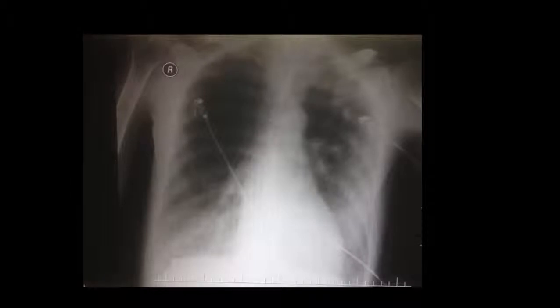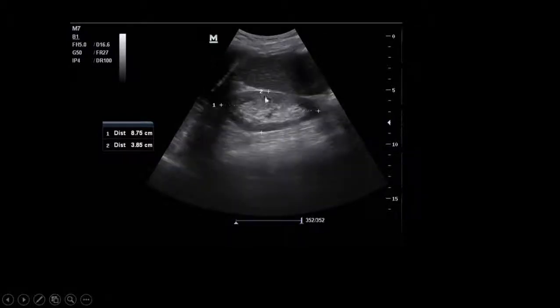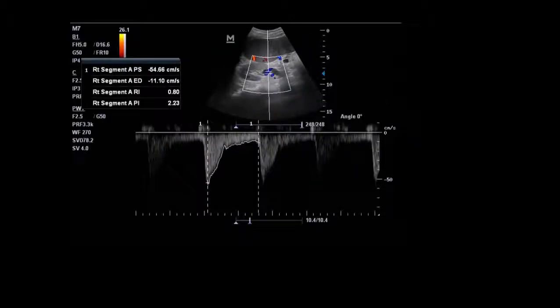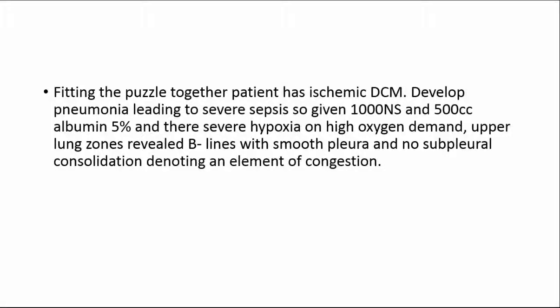The fourth important organ is the kidney. The patient has small, echogenic kidneys bilaterally compared to the liver, indicating nephropathy and chronic kidney disease. Renal duplex showed a resistive index of 0.8, confirming parenchymal renal disease. This is why even one and a half liters pushed the patient toward a congested state.